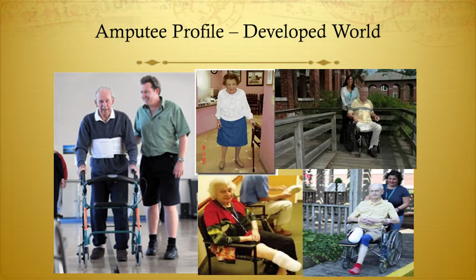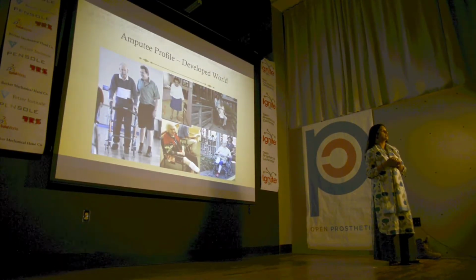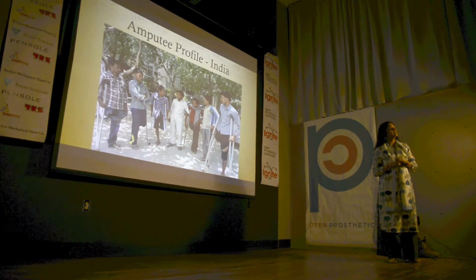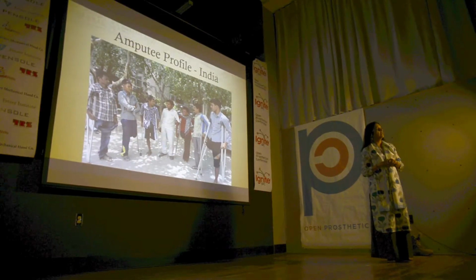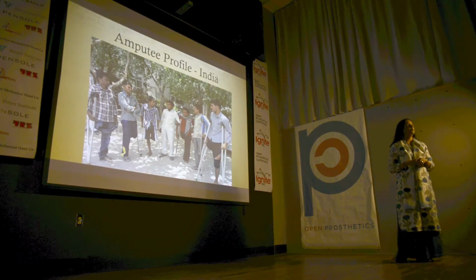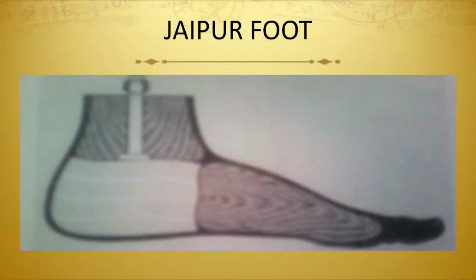That was because the Sach foot is a rigid foot and it does not permit any of the postures our patients have to adopt. Now we have to understand that the profile of users in the West and in India are very diverse. These are Indian amputees who are all young, post-traumatic, live in rural areas, have to negotiate uneven terrain, have to sit on the floor, and may or may not use shoes. So we designed the Jaipur foot, which you just saw.